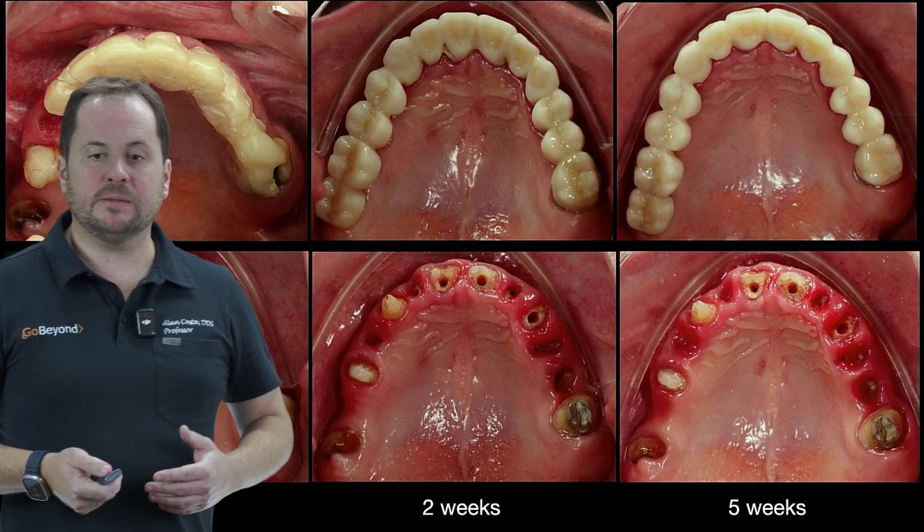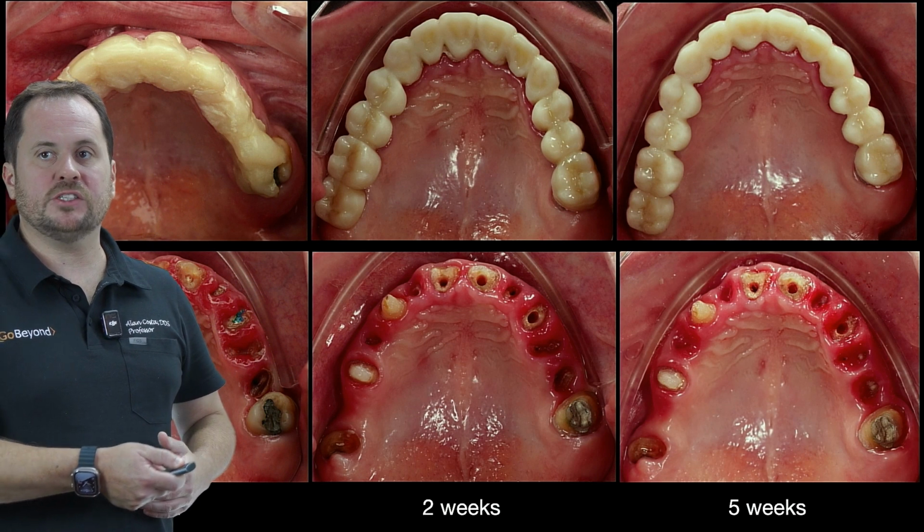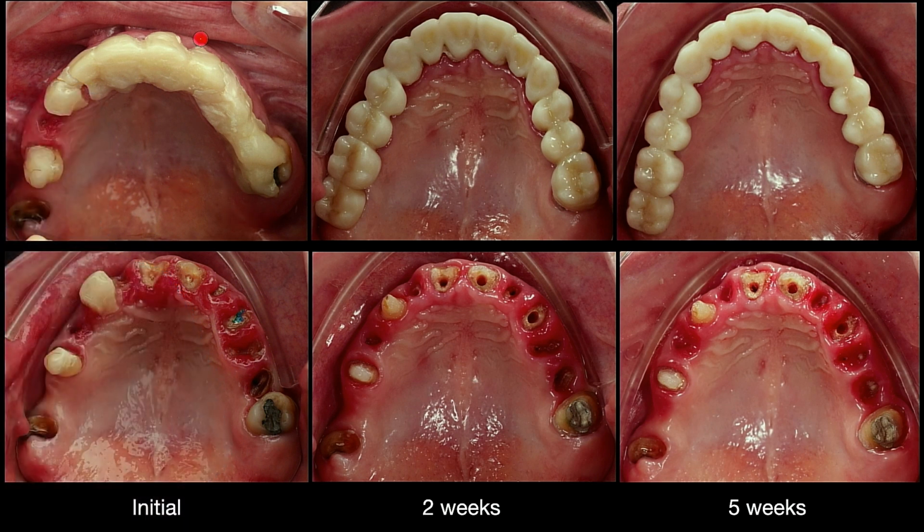And when we place a provisional restoration on the patient, here in the initial situation in this region, we already have a substantial improvement in the tissues around the teeth 2 weeks later, a visible and noticeable enhancement. And many people would even start saying, gosh, maybe I can even save some teeth in this patient. Perhaps, and even place some partial implants instead of doing full implants on this patient.